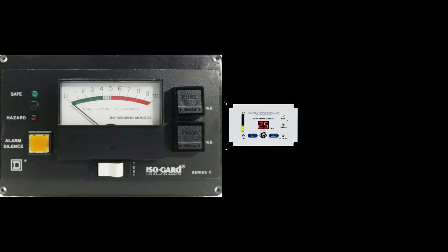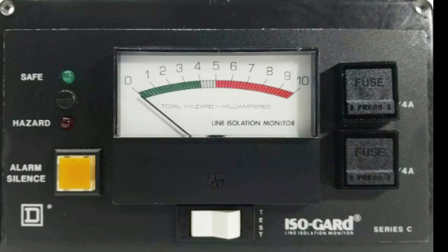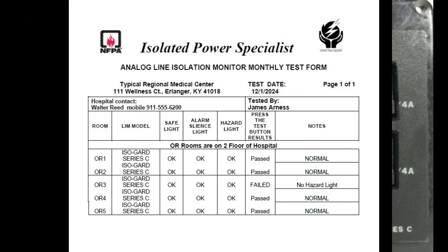There are two types of line isolation monitors and two types of tests. The interval testing required for each type of LIM is different. The older LIMs, like the one pictured here, are called analog type LIMs. They do not test their alarm circuitry automatically. Therefore, to verify that the LIM will respond to a fault, you must push the test button monthly. The results should be recorded on a test form like this.